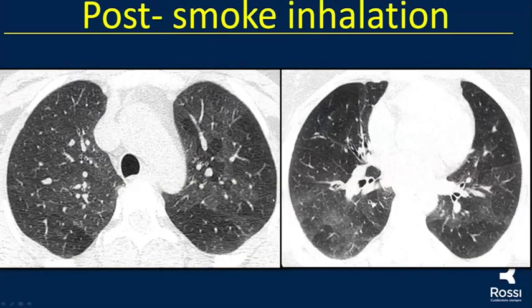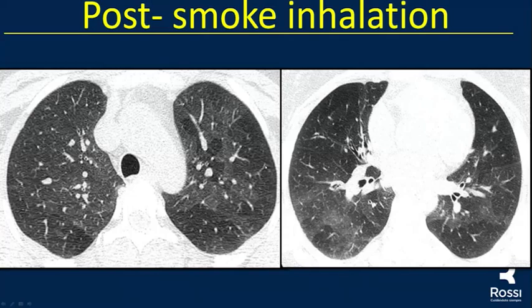This was a patient with post-smoke inhalation air trapping disease. We see the mosaic attenuation pattern with areas of high attenuation and areas of air trapping, mainly in a patient who was exposed to fire in a closed environment.